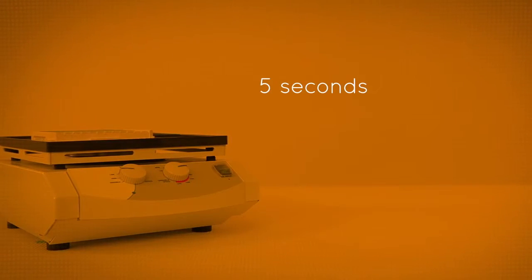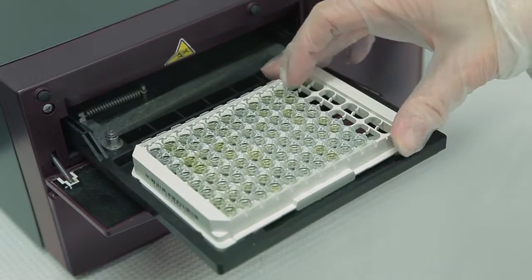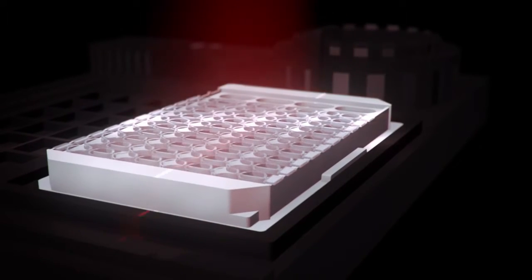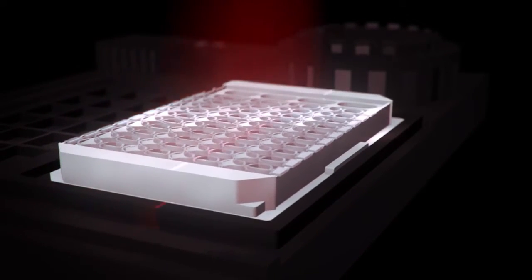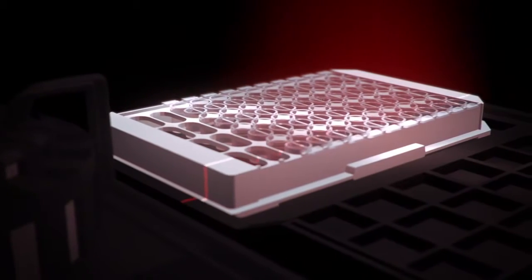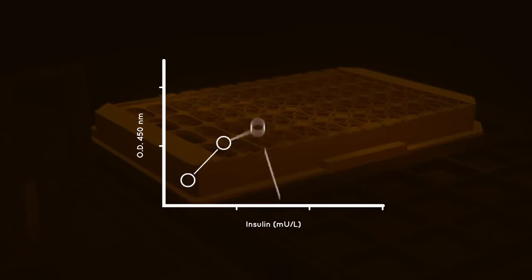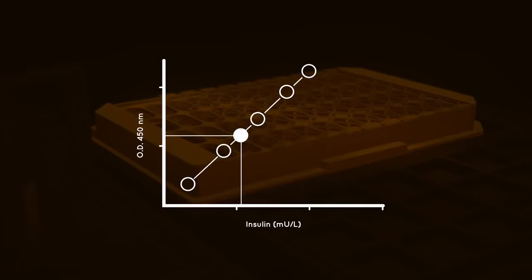Place the plate on a shaker for 5 seconds to ensure sufficient mixing. Read the optical density at 450 nanometers and calculate the results. The absorbance values obtained can be used directly. No blank reduction is necessary. The calibrator curve is plotted using values for all calibrators except calibrator 0. The curve is necessary for determining control and sample concentrations, and thus calibrators must be included in every run.